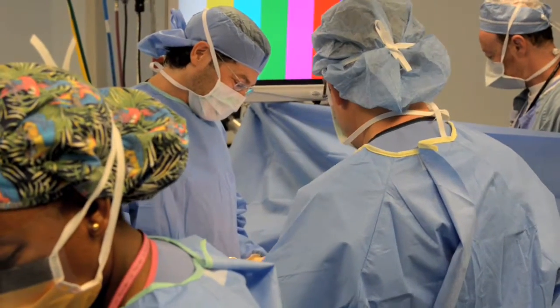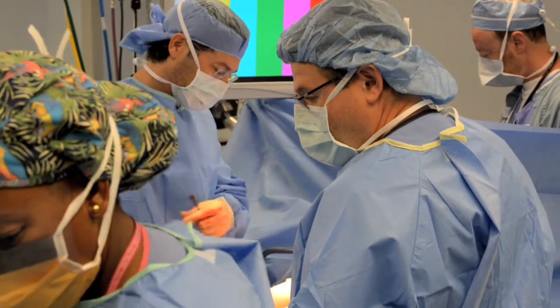All of these procedures are performed laparoscopically, which means they're all done with very small incisions, with very precise instruments, and fiber optic visualization. What that means is that recovery is actually quite quick. Recovery is a matter of days to maybe a week for any one of these operations, and really that's because of the low impact of laparoscopic surgery on a patient's body. We don't make a large incision like we used to in the old days, decades ago. We make very small incisions, either 5 to 10 millimeters in size, and we can accomplish all of these operations through these really tiny incisions, which means less pain and really very quick recovery.